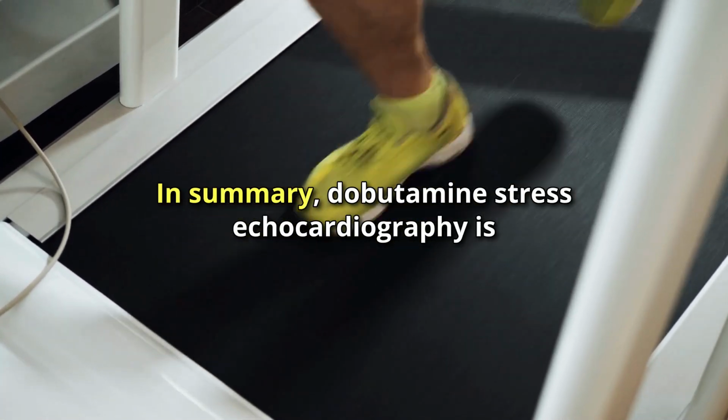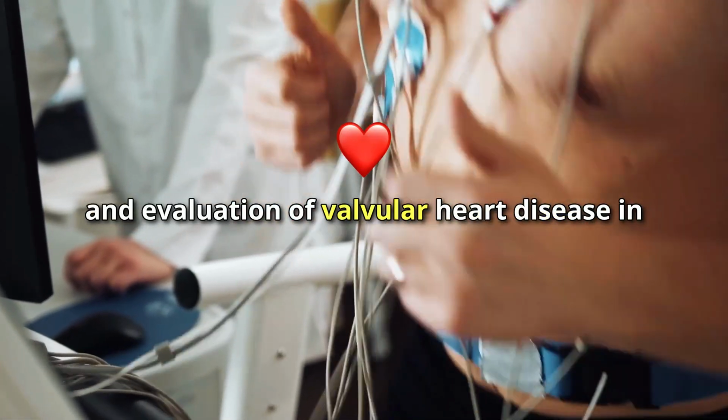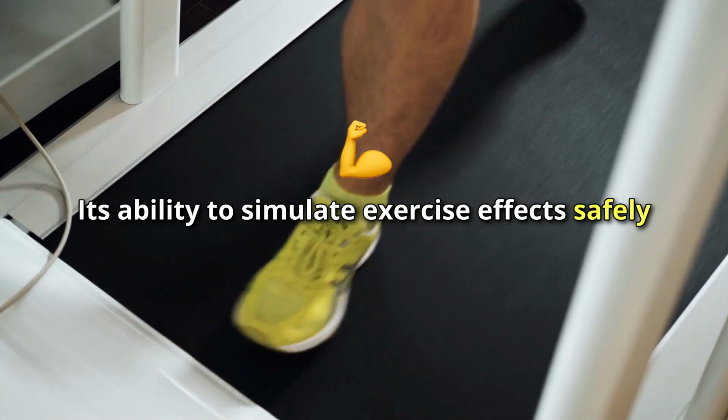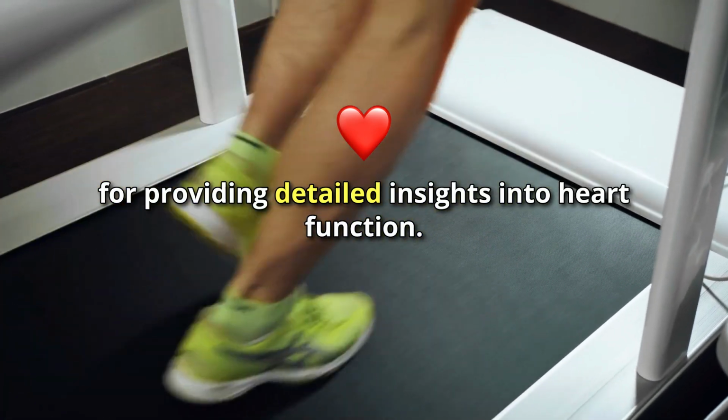In summary, dobutamine stress echocardiography is an invaluable tool in cardiology. It enables the diagnosis and management of coronary artery disease, assessment of myocardial viability, and evaluation of valvular heart disease in patients who cannot undergo traditional exercise testing. Its ability to simulate exercise effects safely and effectively makes it an essential procedure for providing detailed insights into heart function.